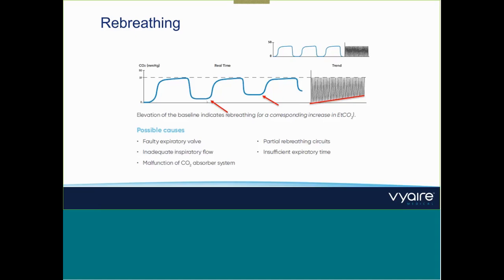And for example, in anesthesia, this is very often seen, but now on modern anesthesia machines you get other indicators that there is rebreathing going on. In the past you could see that you had to change the absorber when the patient got CO2 in his lung again.